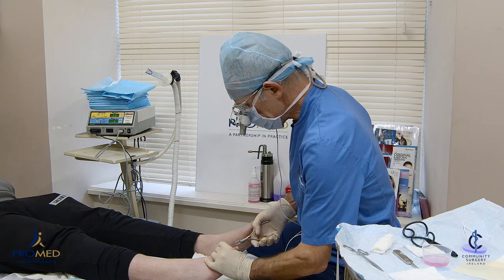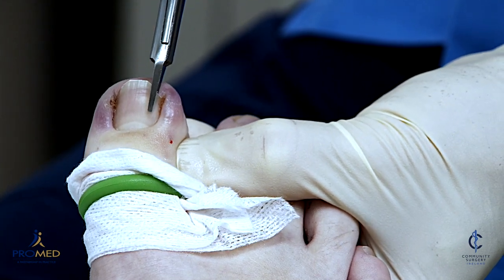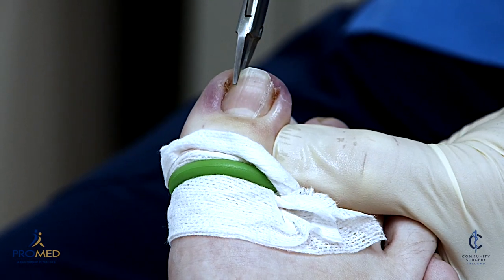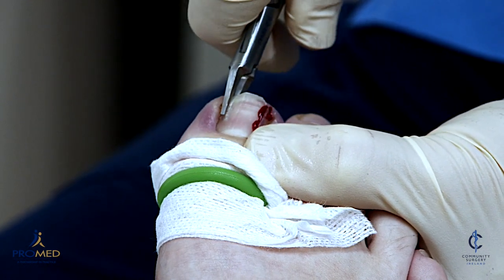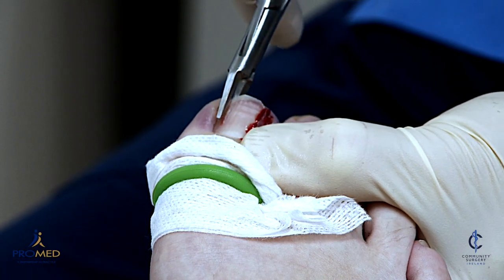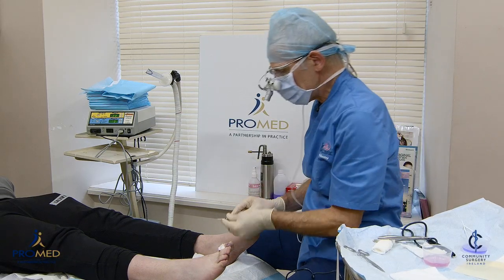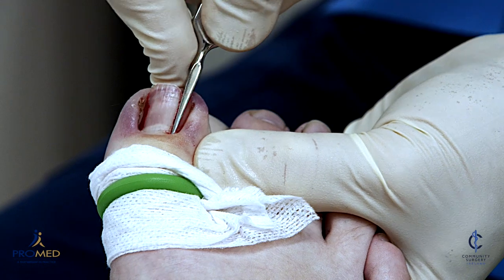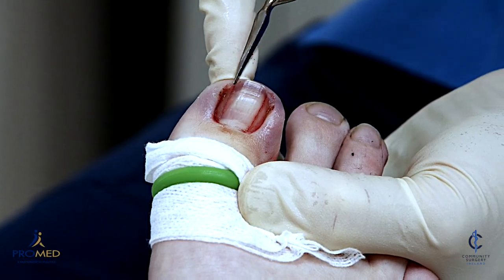This is a nail nippers. We're going to split it down a quarter on either side. Here is a quarter — split it down. And here is a quarter. Once you've cut down the nail, we use the nail chisels — pretty much like any chisel — to split the nail under the peri-ungueal skin. A lot of pressure and we split it right down on both sides.